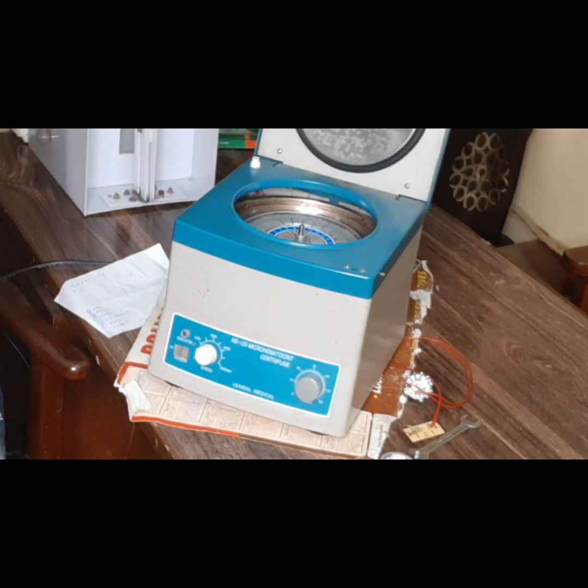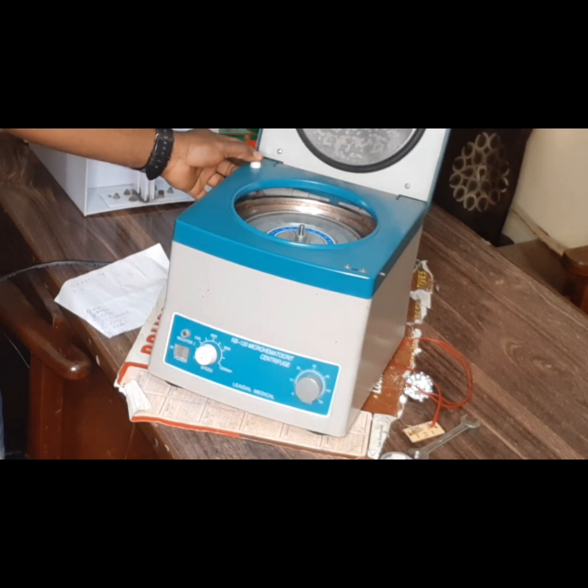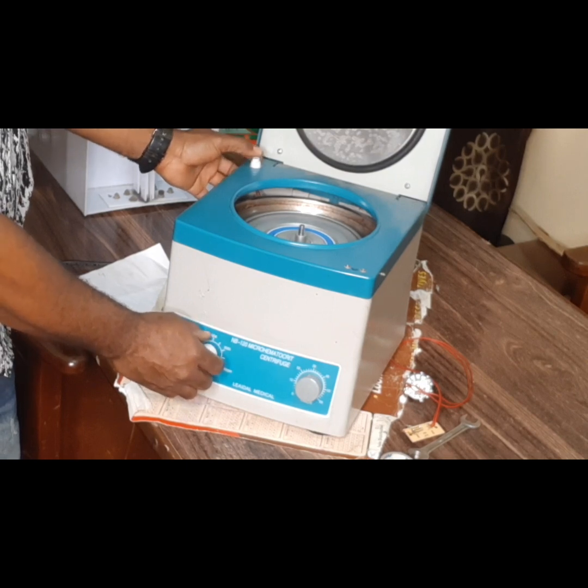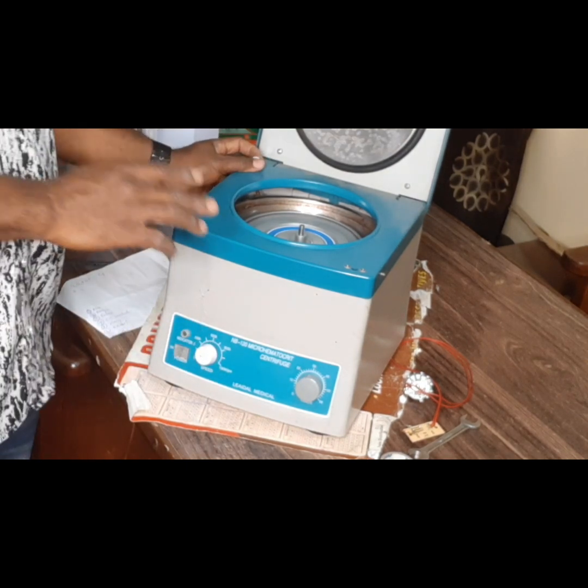But in order for us to see what we are doing, I am not going to close it. I am going to press this switch because what this cover does is to press it on. So I am going to press it to see if it will come on. Have you seen? It's spinning. Can you see? So let me increase the speed. So the most important thing is that it has come on.